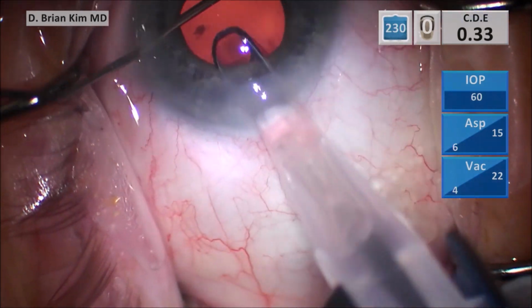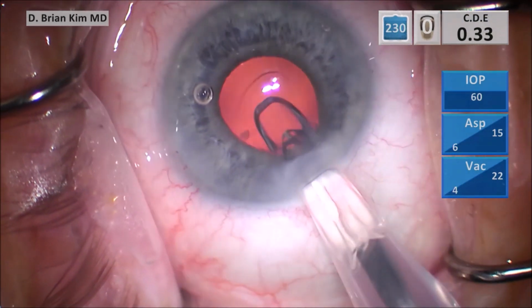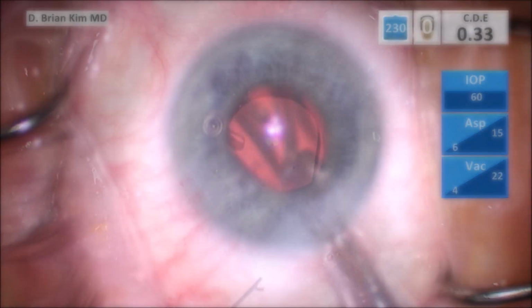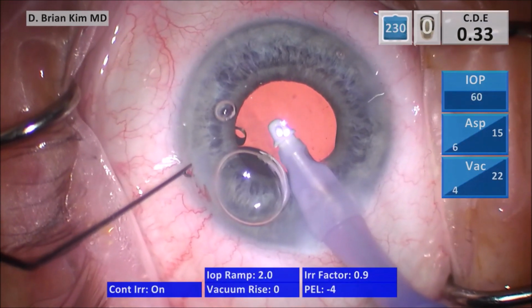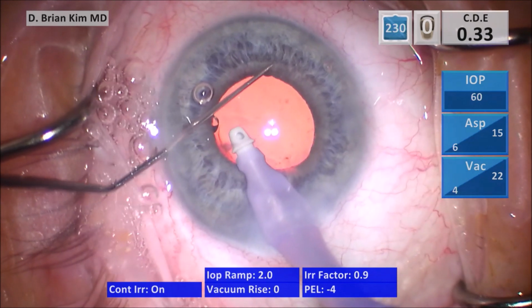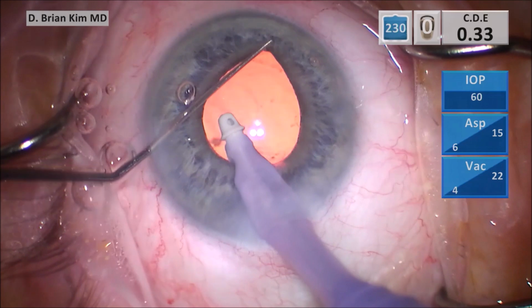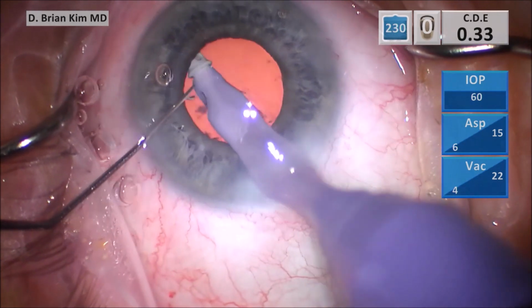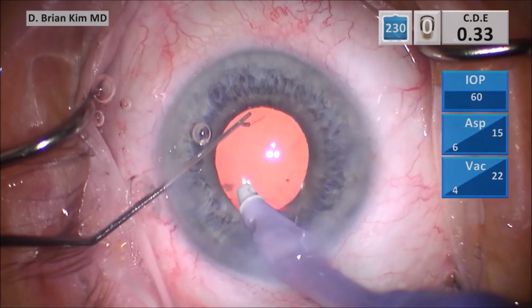I inject the one-piece acrylic intraocular lens into the capsular bag, but I notice I can't see the edge of my rhexis, so I'm injecting the one-piece lens into the bag, and then I'm using the Maltzman to retract the pupil iris so that I can see and confirm that the lens is indeed completely in the bag. Once I'm completely in, I go underneath the lens optic, making sure that both haptics are released. I tilt the optic and then rotate the lens 90 degrees clockwise.